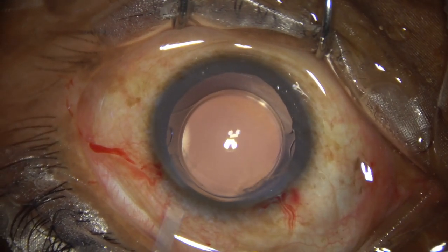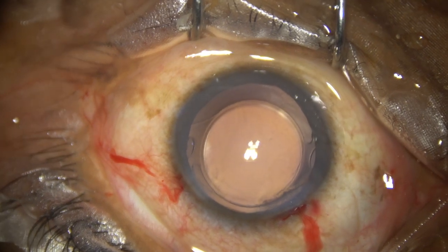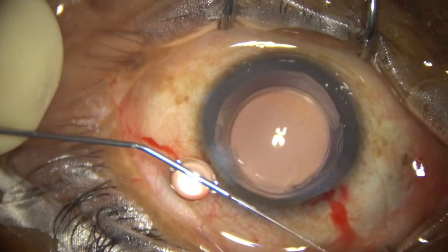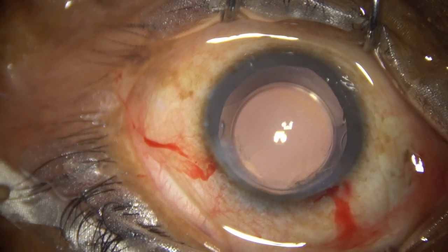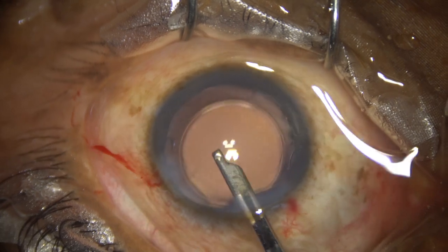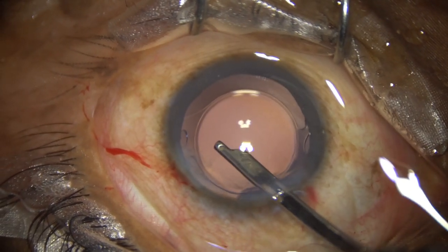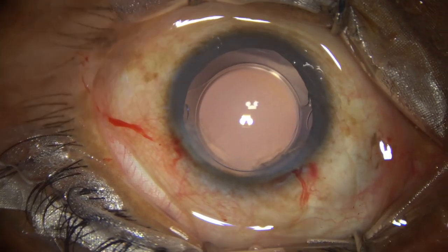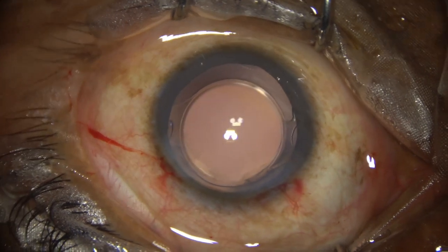Now a bit of moxifloxacin is instilled. The side port is closed by hydrating the corneal stroma on either side of the stab wound. Then a final lavage of the anterior chamber is performed — whatever particles are seen are washed out, leaving pure balanced salt solution. The chamber is formed nicely, and the integrity of all wounds is checked with a cotton-tipped applicator. A few drops of moxifloxacin are applied over the ocular surface.